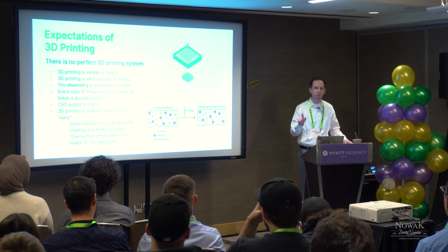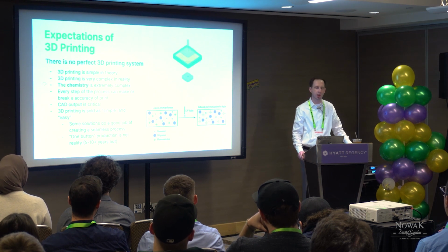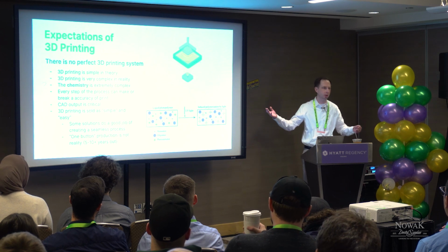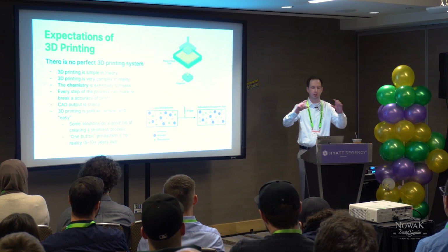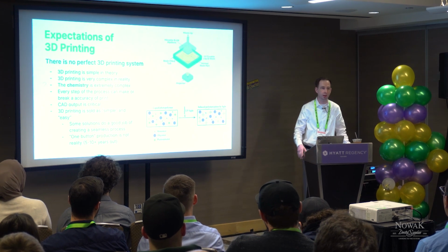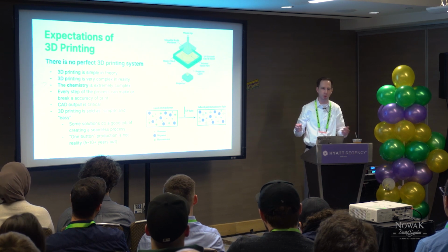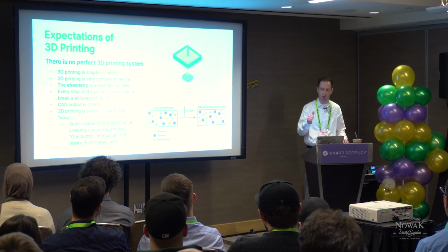And like a one button print and production system, like minimum 5-10 years out. It is still a very new technology, and I think a lot of people forget that. You know, in dental milling, from Lava and those blanks in 2005-ish, to where we are today, it's very mature. It's plateaued in technology. You're not seeing much else, more disk changers or whatever, and maybe some improvements on the software side, which is good.